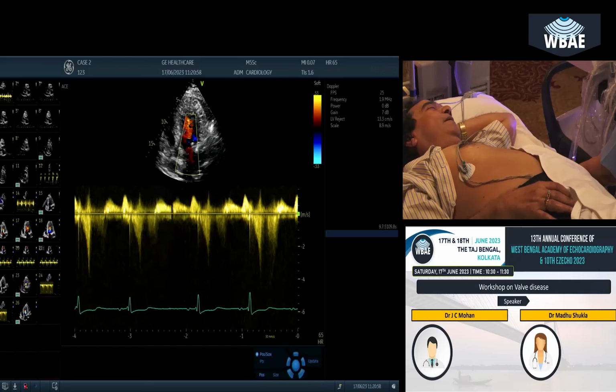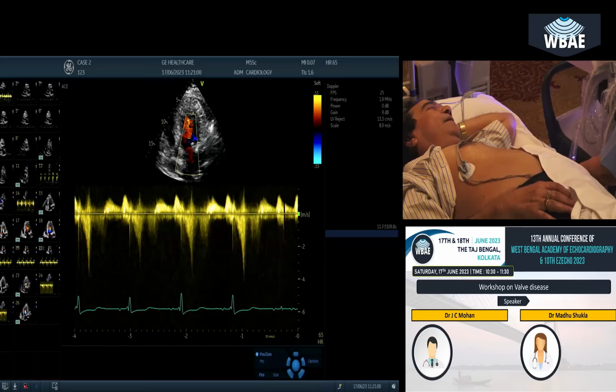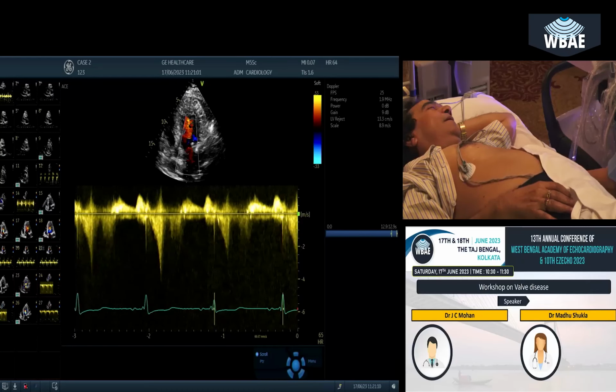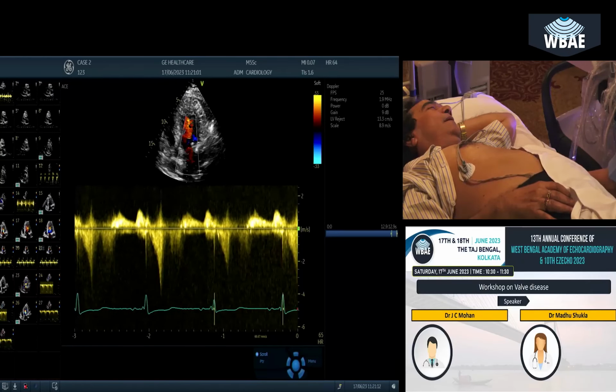I was trying to look at any isovolumic relaxation wave during IVRT here. So I'm not getting it. Sometimes you see big waves there because of regional heterogeneity in the fall or decay of the intraventricular pressure. Pardon? Yes, it looks like MR.